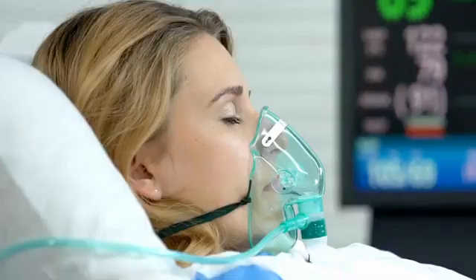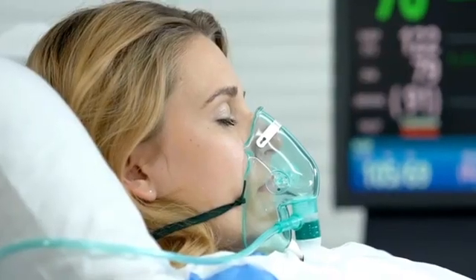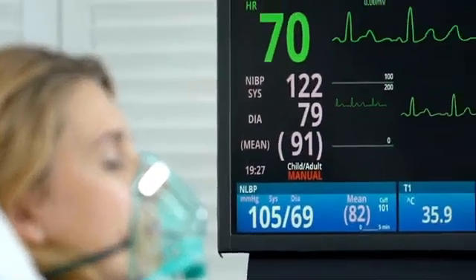Today, I'm gonna change things up with a photo pop quiz, as I want you to identify the different types of oxygen masks used in a hospital setting. So I'll show you the oxygen mask for about 10 seconds, and shortly after, I will identify the type of oxygen mask that was shown with a quick review.